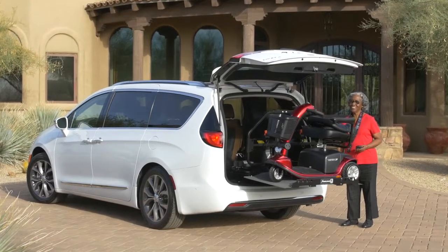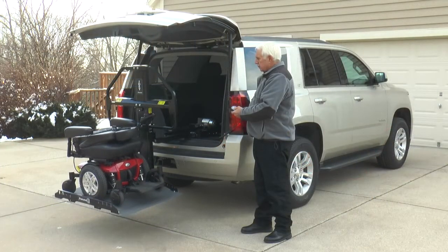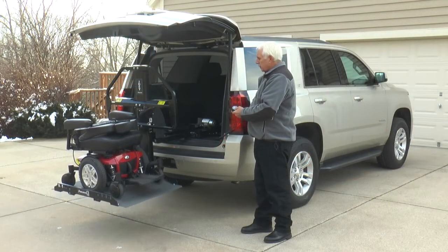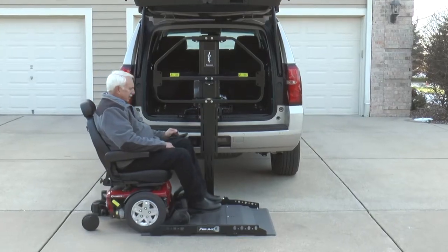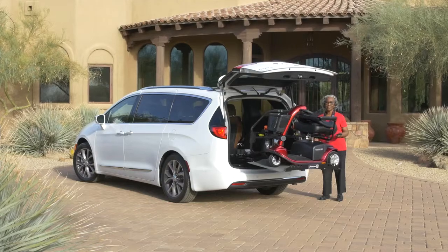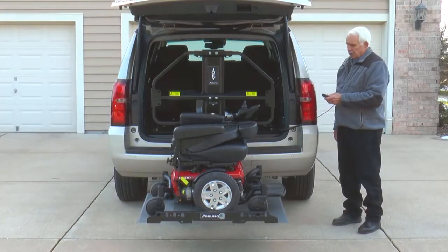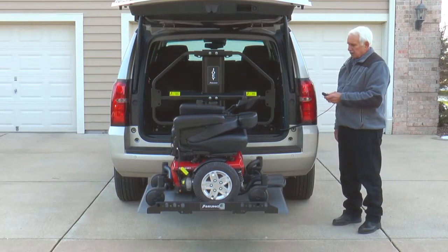Transporting a scooter or power chair doesn't get easier than with Bruno's Joey. Designed for select SUVs, crossovers, minivans, and full-size vans, the Joey offers a drive-on, drive-off platform and one-button simplicity to quickly and easily load mobility devices weighing up to 350 pounds or 159 kilograms.